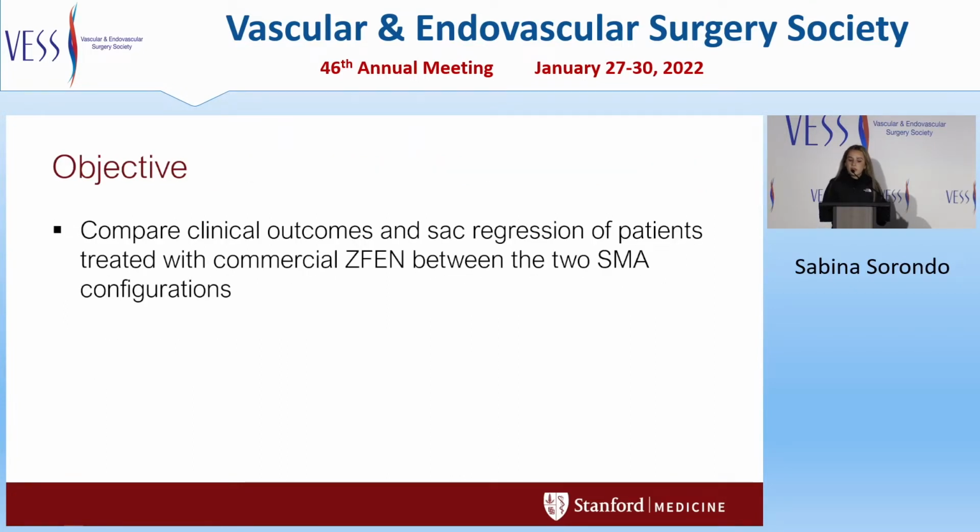Clinically significant outcomes comparing SMA scallops to large fenestrations with the available Z-Fen device are lacking. We sought to compare clinical outcomes and sac regression of patients treated with the commercial Z-Fen between the 2 SMA configurations.